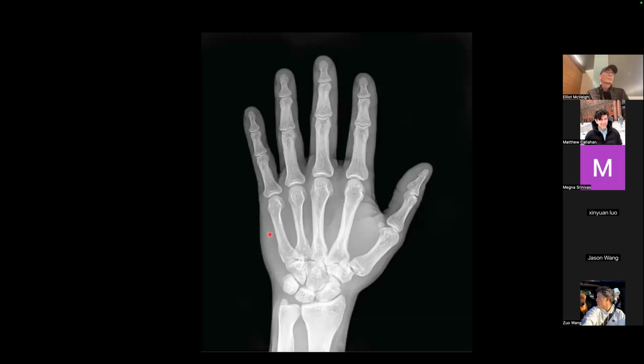Traditionally, this was a film target. So in those places where you get a lot of light or a lot of X-rays, the film gets exposed, and so it goes dark. Those places where you don't get a lot of X-rays, when you put the film into the chemical composition that develops it, those crystals come off and you can see through.